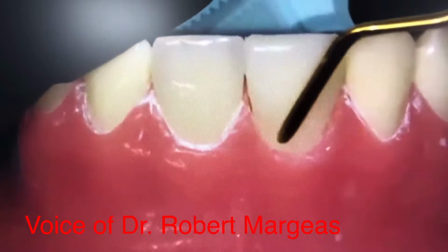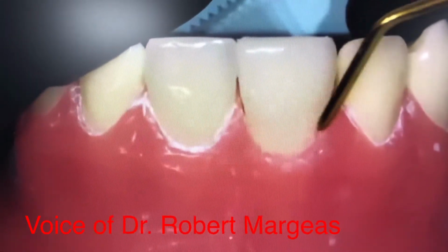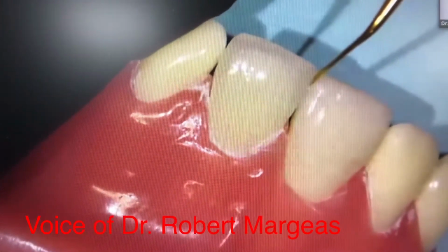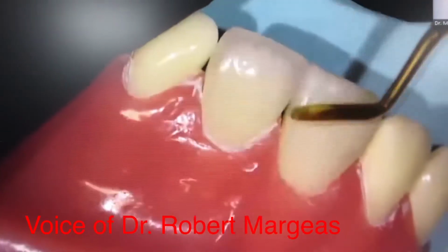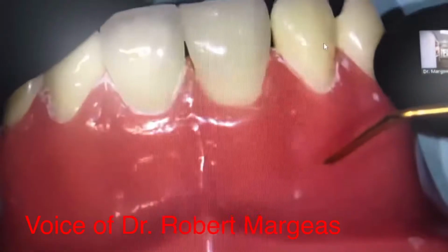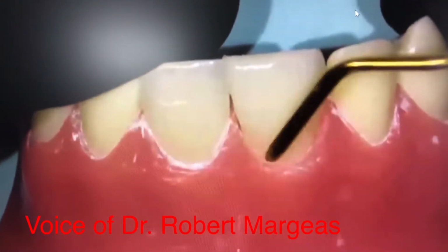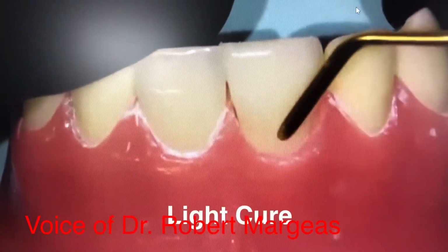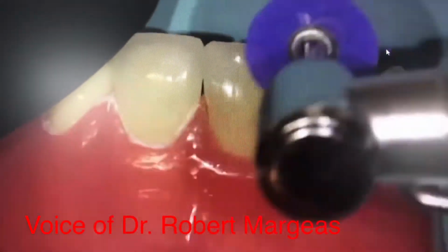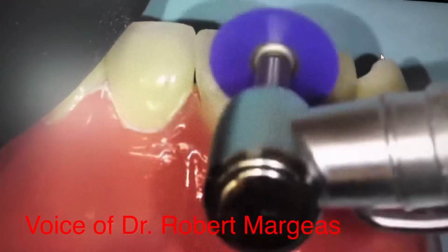Making sure that I don't have any margins. Like here. Try to get it as perfect as possible so you have less anything. Okay. The incisal. And I do this dry on lower speed.